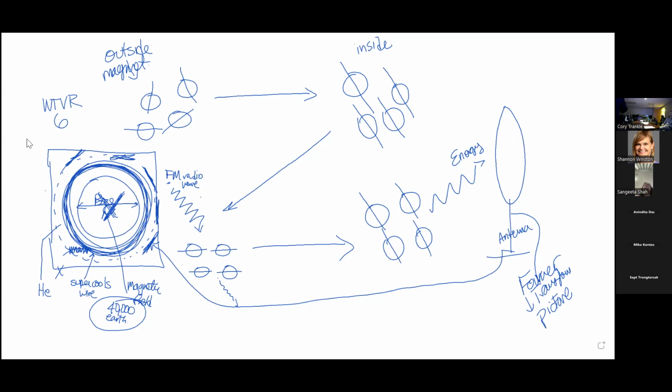these electrical outlets. So the second reason that that thing is in a room is to keep the electromagnetic radiation from the environment from interfering with the scanning process. Okay? Two reasons. So in the cath lab, we want to keep something that's in the room from getting out. In the MRI environment, we want to keep things from outside getting in. Ferromagnetic metal, ionizing, not ionizing, but electromagnetic radiation that's not ionizing, okay?